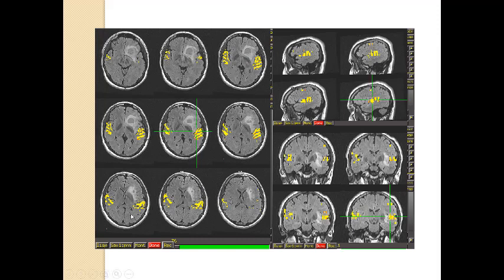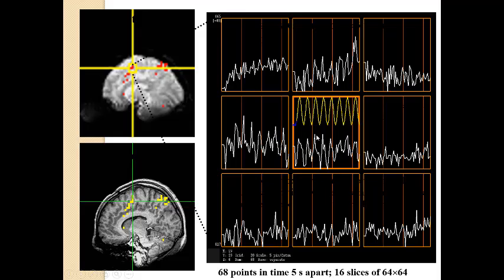designed for fMRI analysis. The way it works is it detects changes in the BOLD signal, which we're seeing here down here in white, and then it attempts to match them to a modeled signal. So in this case, if you think about it as a finger tap, you're going to tap your fingers for 10 seconds, tap, tap, tap, tap, tap, and then you're going to stop. Right?